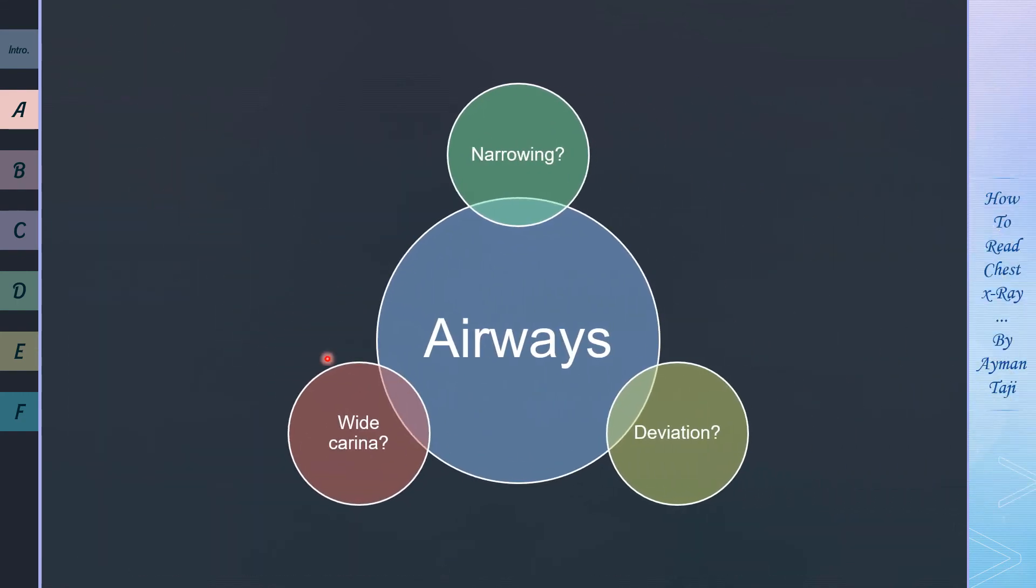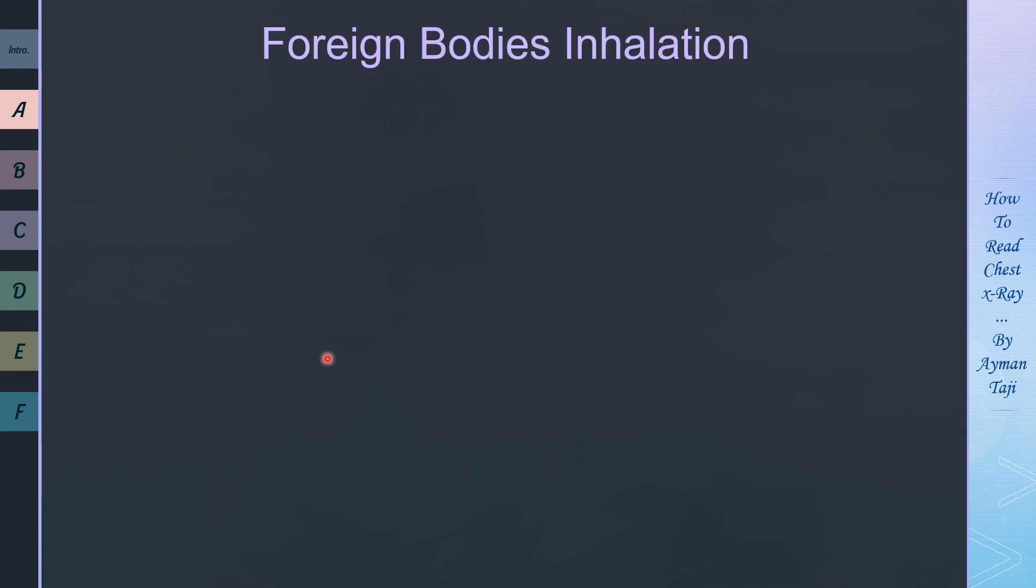So when you check the X-ray, don't forget to ask yourself these three questions in assessing the airways: is there any narrowing? Can you see any deviation? And is the carina wide or not? Finally, I just want to mention a not so common but very important and potentially fatal case, especially in children, which is foreign body aspiration.